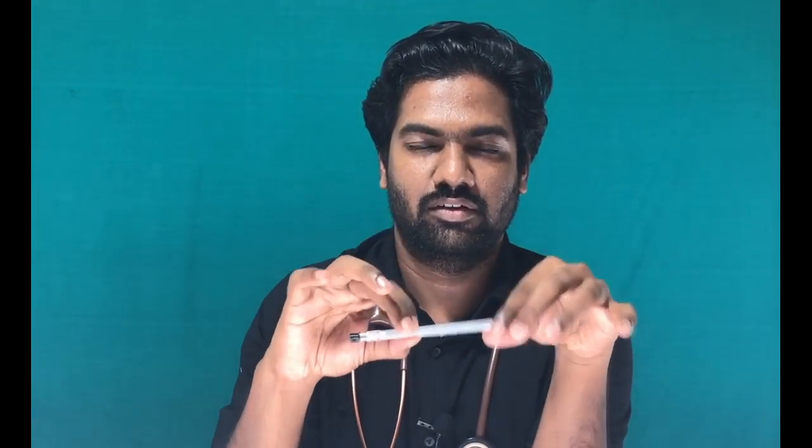This is a spinal needle which I want you to identify first. If any examiner gives you this, you should identify that this is a spinal needle, or lumbar puncture needle. Anything is good. Are we good?